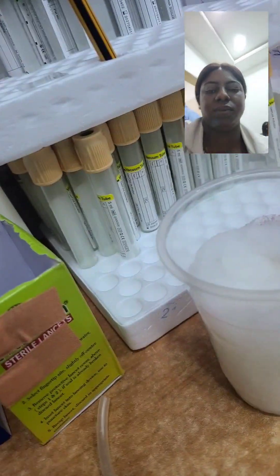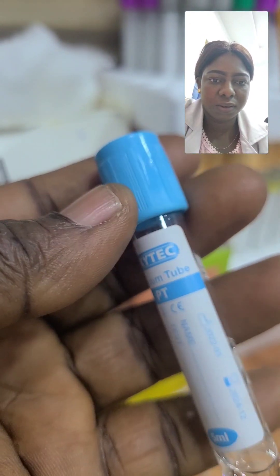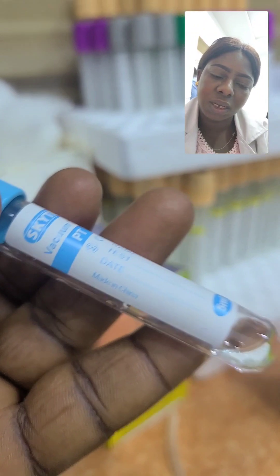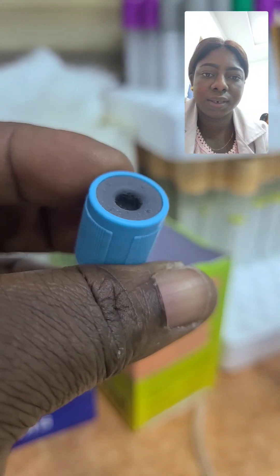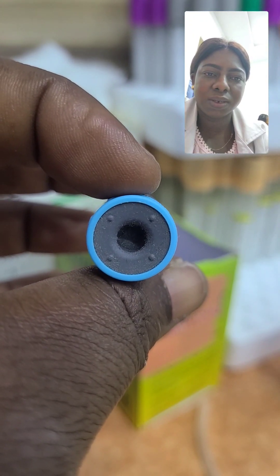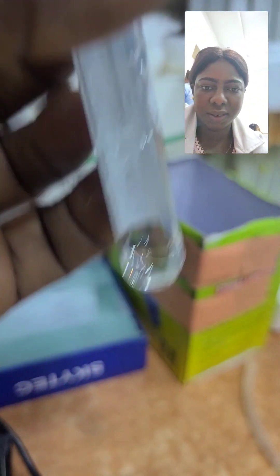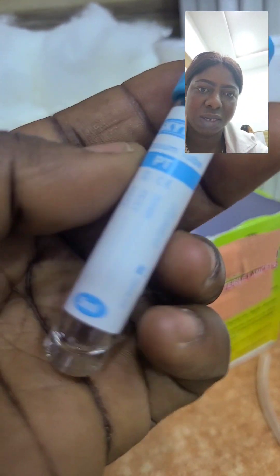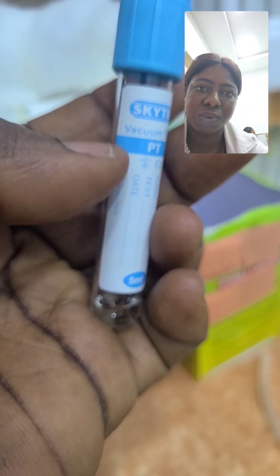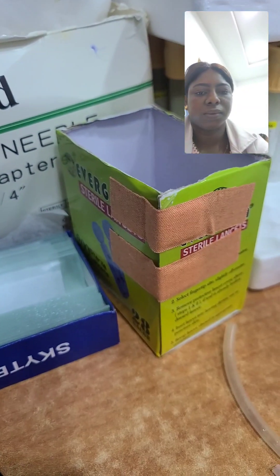Here is a sodium citrate bottle. We use it for assessing coagulation and the clotting system — we use it to collect clotting profile samples, all tests that deal with the clotting profile. As you can see, it contains sodium citrate and it is an anticoagulant.